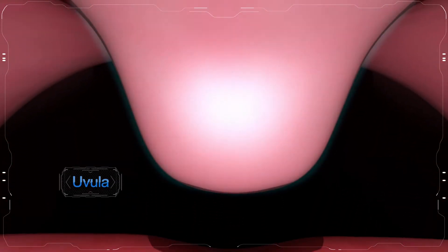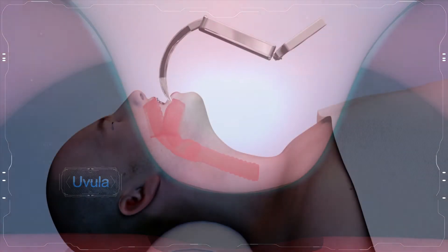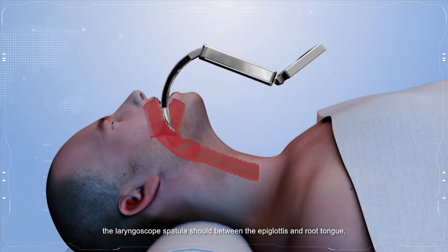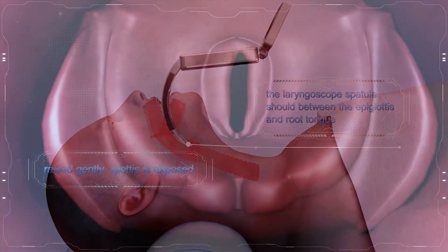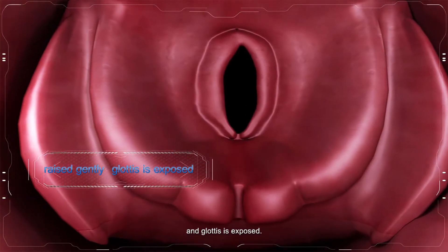After passing the uvula, the laryngoscope spatula should be positioned between the epiglottis and the root of the tongue. Then raise gently until the glottis is exposed.